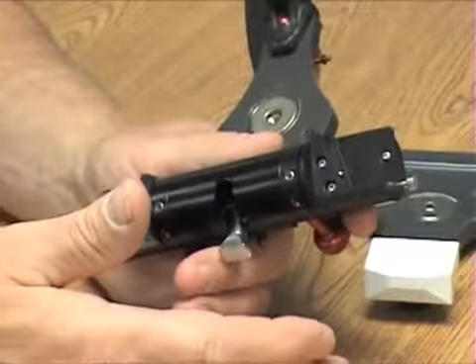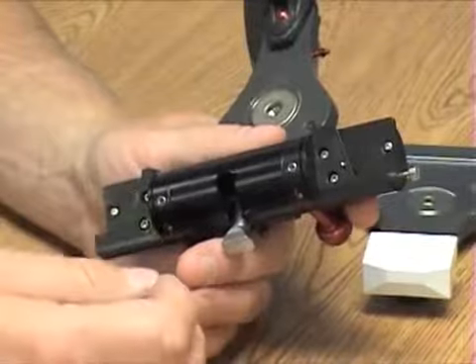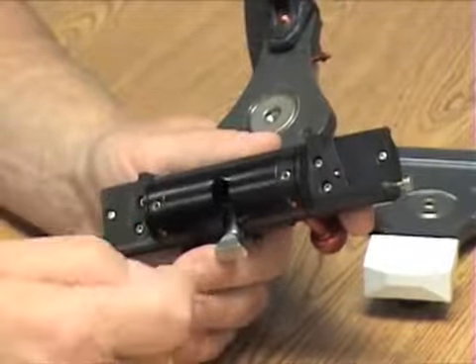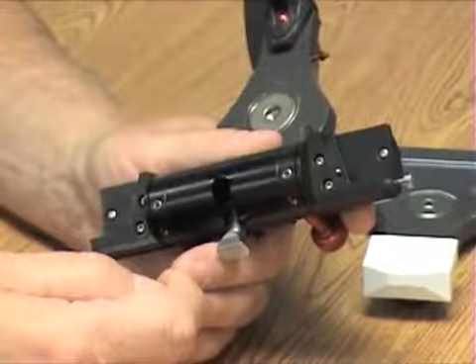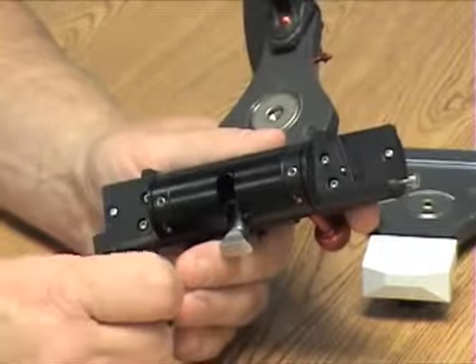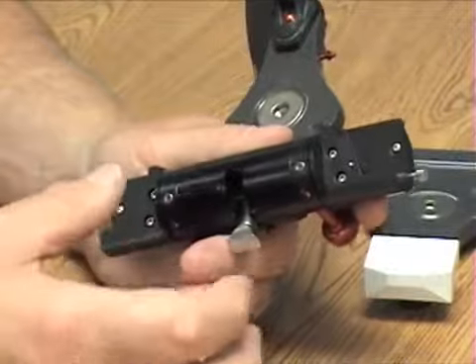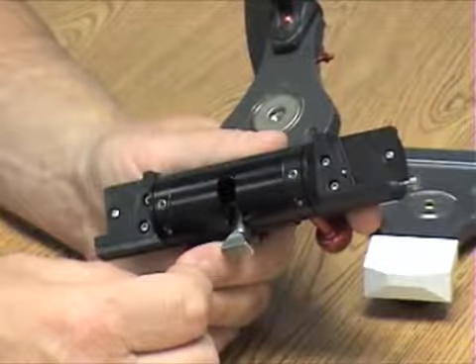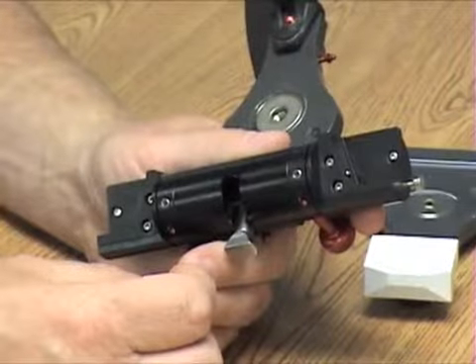As metal wears on itself, you can have a couple of different things. You can have an issue where it will gall up and no longer function, or you can create wear. What we're trying to do with the lubrication is prolong the life of the articulator and cut down on the wear and tear of the articulator as well.